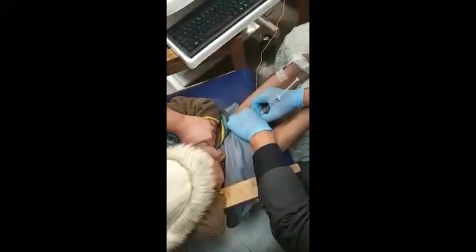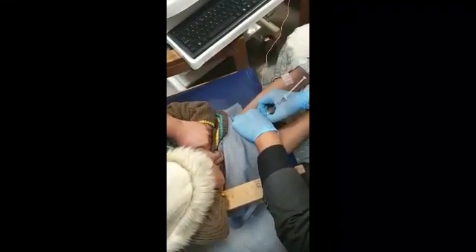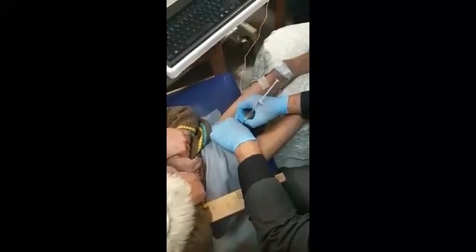If you're not doing EMG guidance, you may need a much higher dose because of missing the muscle or being around the muscle. When the leg is very tight and you cannot open the two legs out and cannot feel the adductor properly, you are going by your best anatomical guess on where the injections should be done.